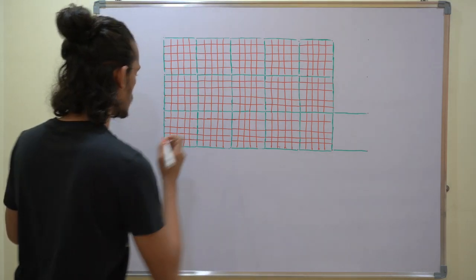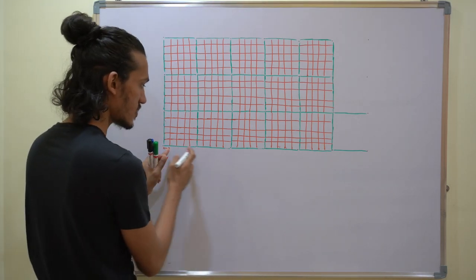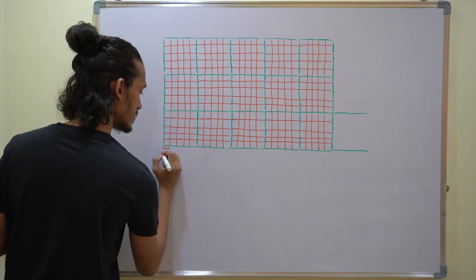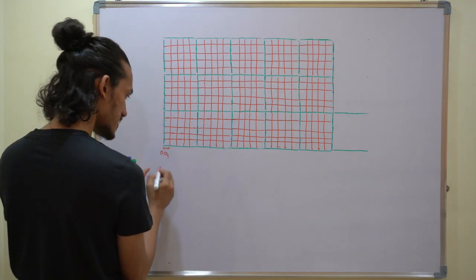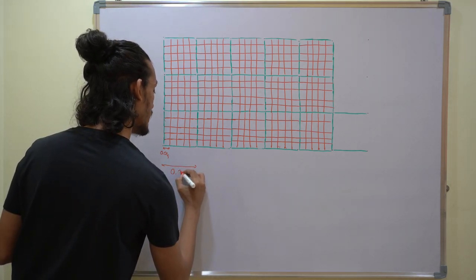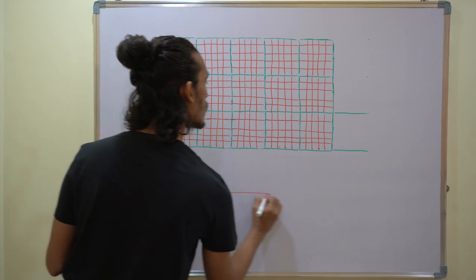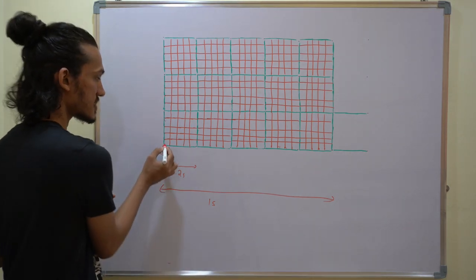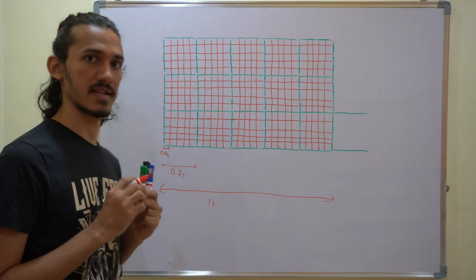So as you can see over here, this is 1 millimeter division, right? 25 such 1 millimeter divisions make up 1 second, right? So this one division is 0.04 second. 5 such divisions would make up one large box, and that is 0.2 second. And this whole division would make up 1 second. So this is 0.04 second, this is 0.2 second, this is 1 second. That is the first thing you need to understand, right?